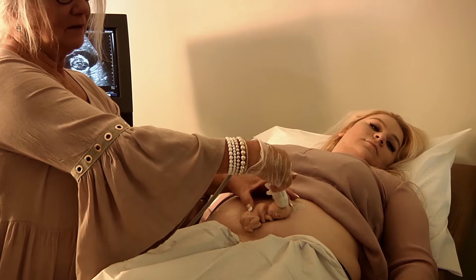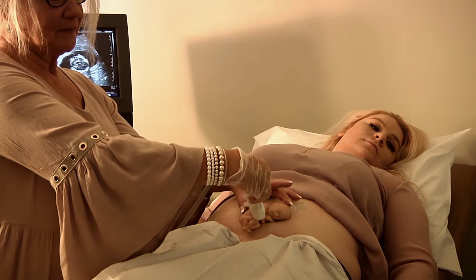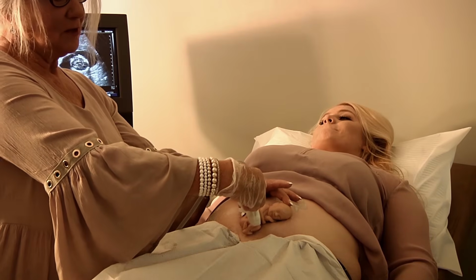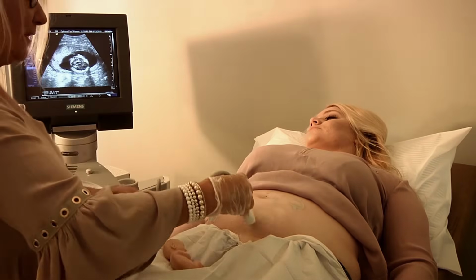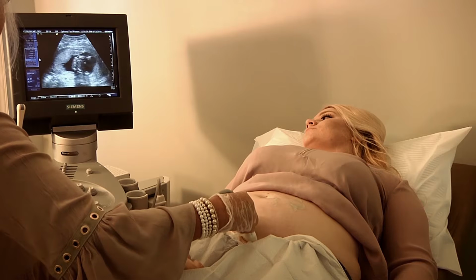Now to get the heart, where are we going to go? We're going to go down the road, the heart. Then we're going to keep going and going to see the femur. And then we're going to see part of the femur, but we got to stretch the femur out. So we're going to turn and rock until we stretch that femur out. So let's see what we got here. We got our head traveling down the road.